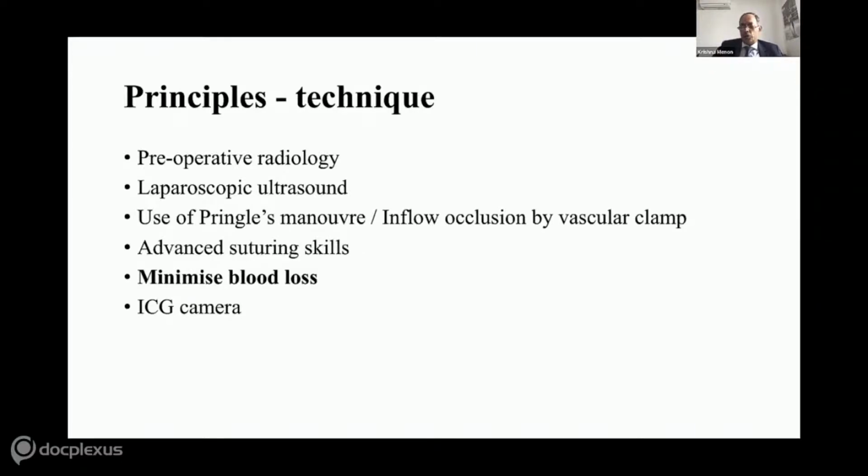As I said, I always use an extracorporeal Pringle, and we use 10 minutes on, 5 minutes off, 10 minutes on, 5 minutes off. And all my parenchymal transection is done using a Lotus parenchymal transector, which allows me to use it as a Couser as well, and I'll demonstrate this in the video. Extraction is all done through a Pfannenstiel incision.